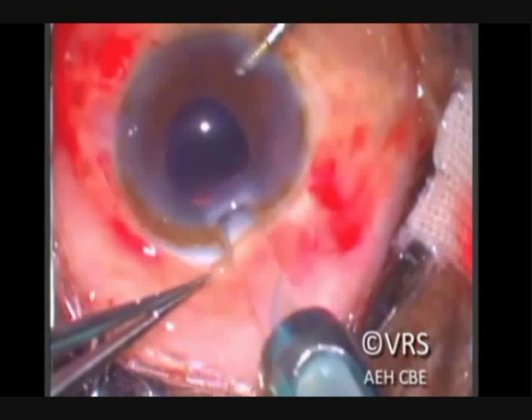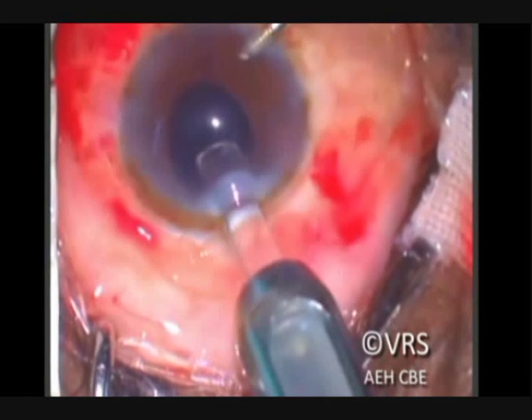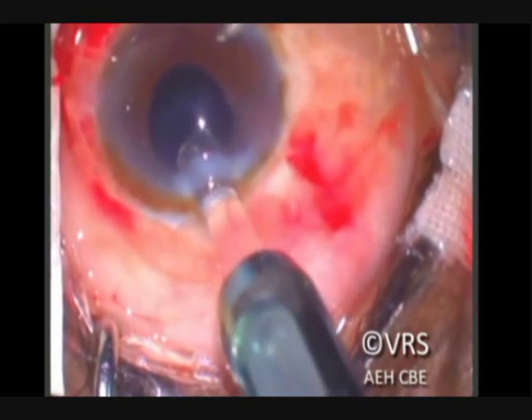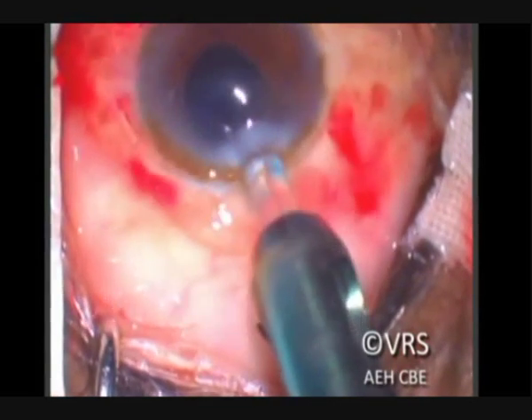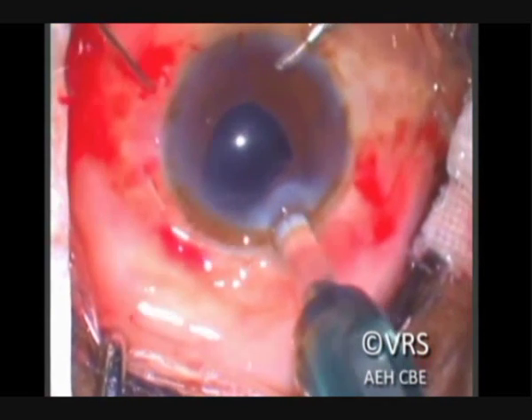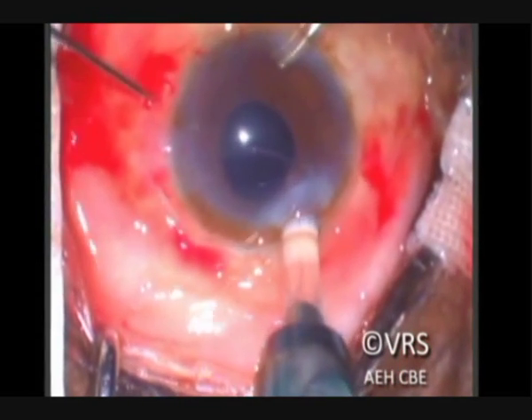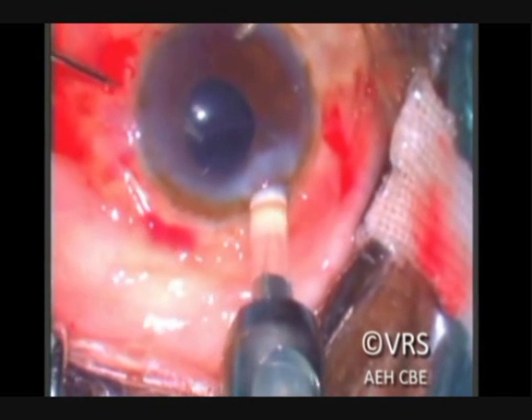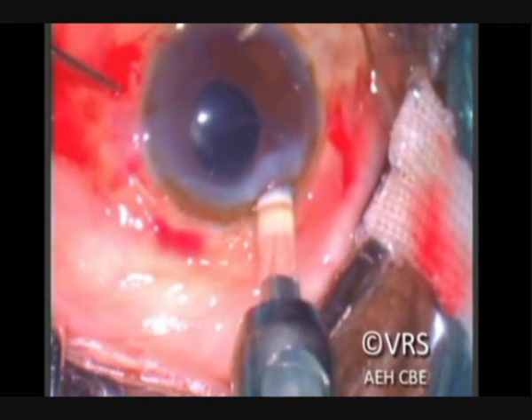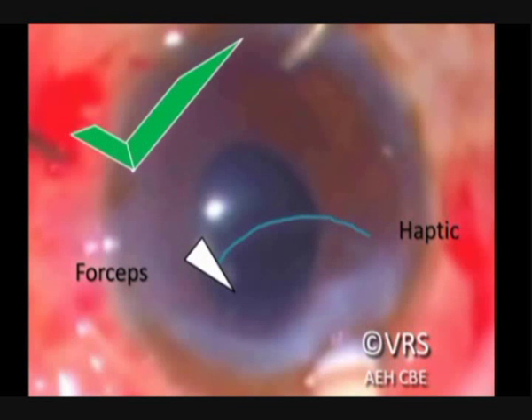As the leading haptic is injected into the anterior chamber, it is held with the 25 gauge MIVS forceps — in this case the Alcon Grieshaber Max Grip forceps, which gives good strength in holding the haptic. Care should be taken to hold the exact tip of the haptic. If part of the haptic juts out beyond the level of the forceps, then as you are pulling out the haptic, it can get kinked or in some rare cases fracture can happen.